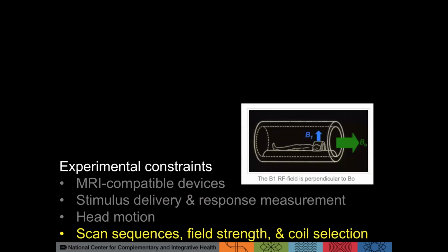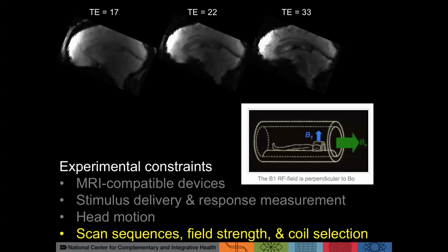Finally, most people who have an fMRI scanner at their institution might have recommendations from the local MR physicist about what imaging sequence to use to collect fMRI data. But the selection of sequences actually may depend critically on your questions. So here are different examples.